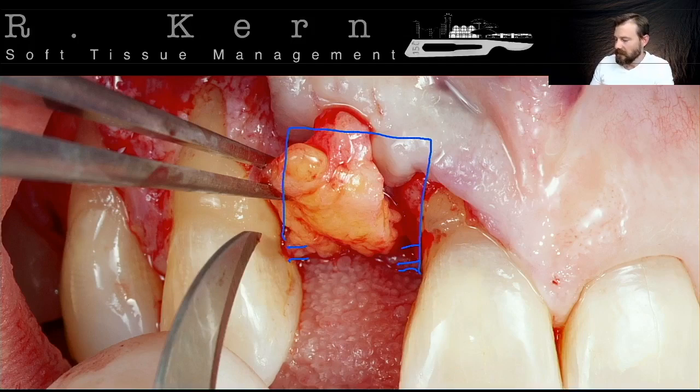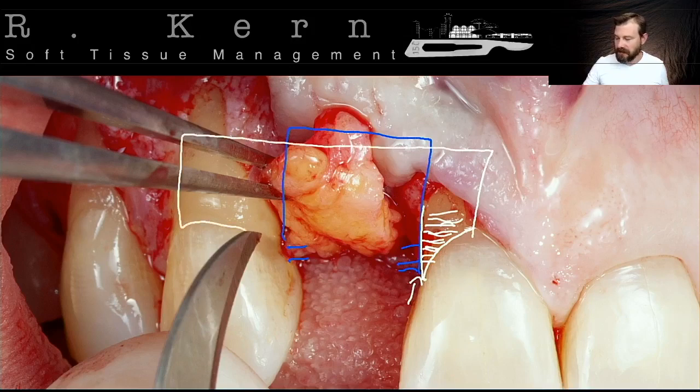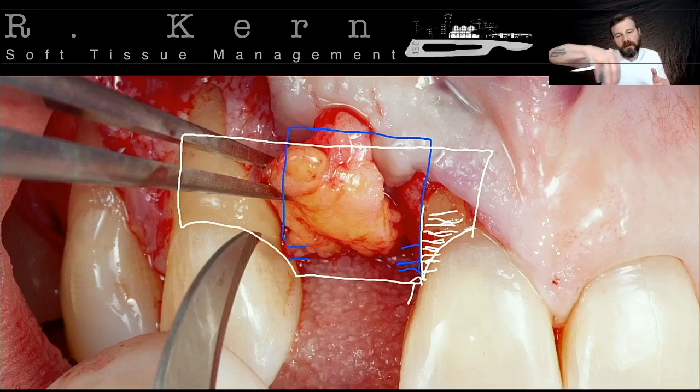Why is that? This area here, just under the papilla, when you are contouring the crown, if you leave this area empty, a void there, when the tissue and the flap start to heal, with this absence of mechanical support, usually the papilla just recedes a little bit. So when designing a graft, we need to leave the graft more or less with this C shape. We need to fill this border on the buccal contour with the connective tissue, okay?